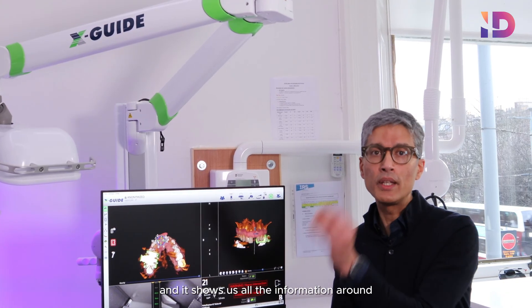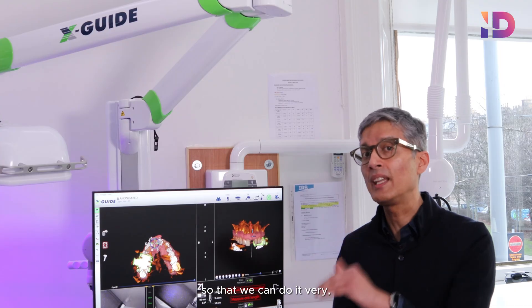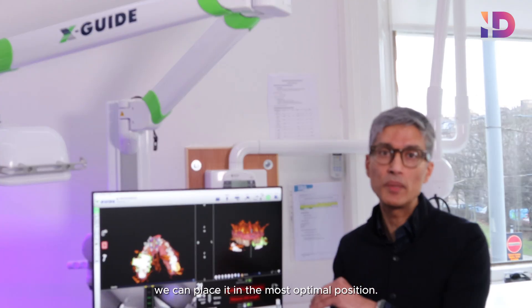It shows us all the information around where the teeth are and where the important structures are, such as nerves and vessels, so that we can do it very accurately and very safely, while at the same time placing it in the most optimal position.